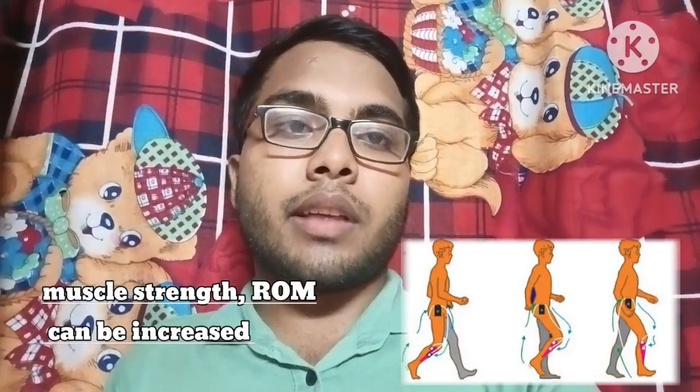The next one is FES, meaning functional electrical stimulation. It is the use of electrical stimulation during a task, during a function. For example, a patient has foot drop, so he faces difficulty lifting his toes when walking. That causes a decrease in step length and walking speed, which is a very big problem for him. For the treatment, FES is applied to the muscles which help lift the foot, the dorsiflexor muscles, and that helps the patient lift and clear the foot during walking. By this use, the muscle strength and ROM can be increased.